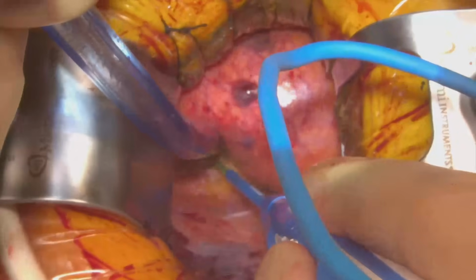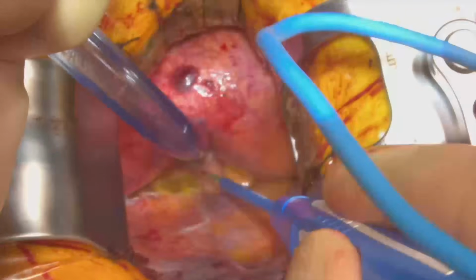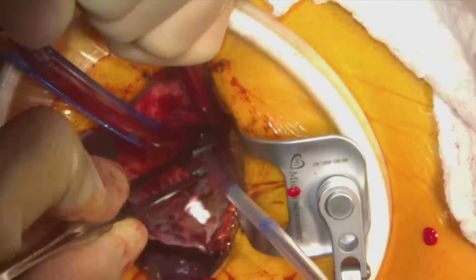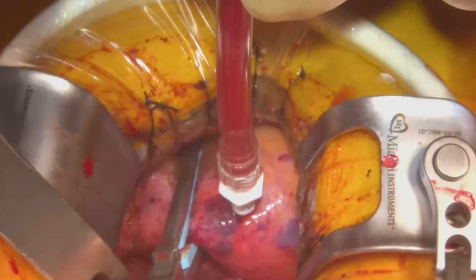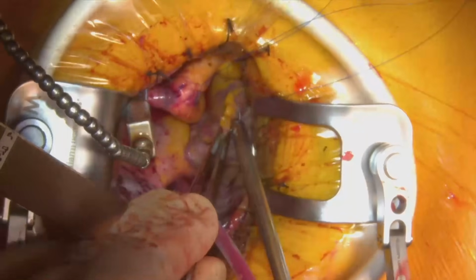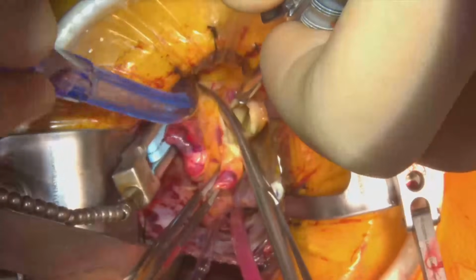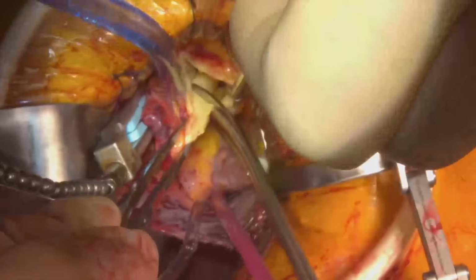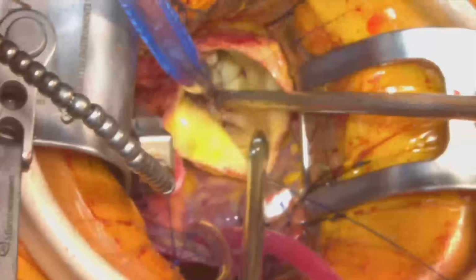Cardiopulmonary bypass was initiated, and cooling was begun. Once the heart fibrillated, a cross clamp was applied and cardioplegia delivered in the antegrade fashion. The right atrial appendage was retracted to improve exposure. Next, an aortotomy was performed. The valve was exposed using stay stitches, and valve excision was performed in a standard fashion.